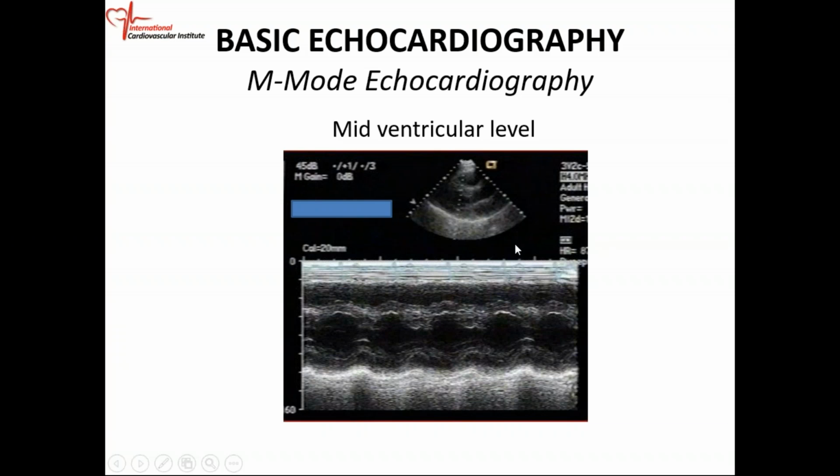Okay? So you can measure the thickness of the chest wall if you want to. It's close to 20 some, probably 22 millimeters. All of this represents the chest wall. Below the chest wall, you have your pericardium, and then below the pericardium, you have the RV wall. The RV wall is right down here. Below the RV wall, you have the RV cavity. Then you can see that the cursor crosses the RV cavity, then it gets to the septum. So this is the septum, okay?